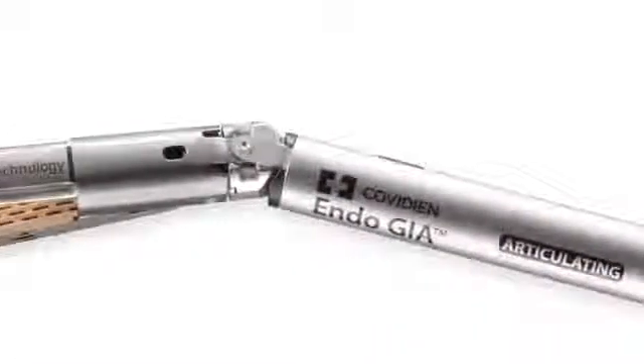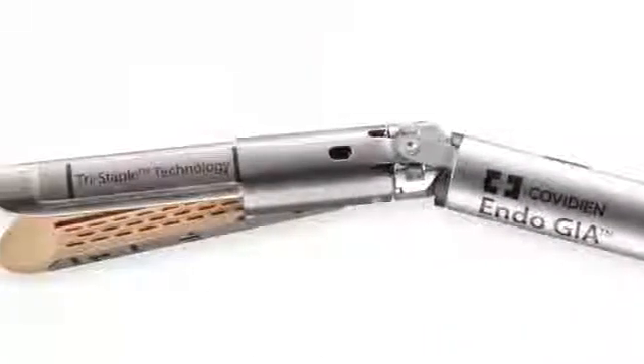Specifically when it comes to liver surgery, I personally like to use a combination of energy and stapling technologies. I think it's important to choose the proper length of staple so that you don't have excess staples laying around, which will impede your use of certain energy devices. It behooves us to have a good stapler that we can trust to make sure that we're doing the best job we can for our patients.